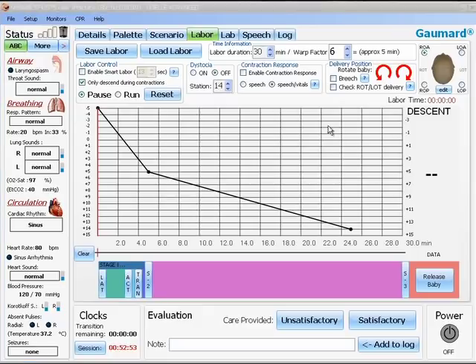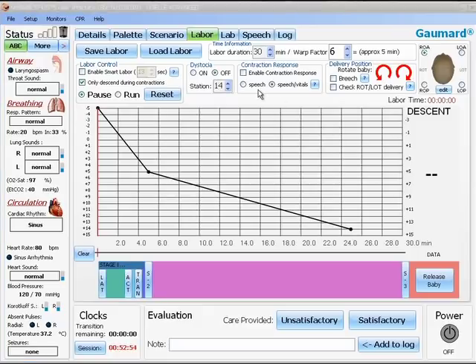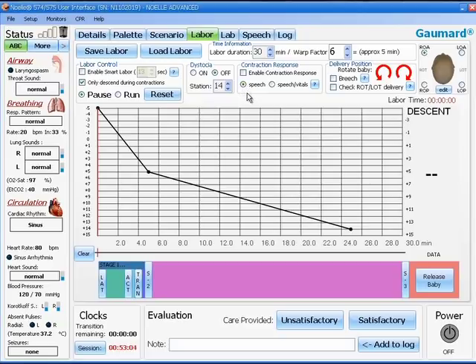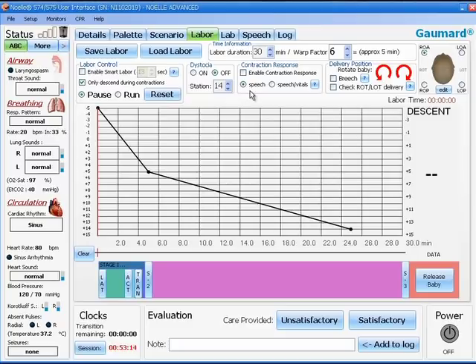The next box is entitled contraction response. There are two possible responses to contractions. One is a speech response, whereby Noelle will react to a contraction with speech palettes. If you select both speech and vitals, there will be a speech palette response and an increase in the breathing rate and the heart rate during each contraction. The check box turns this contraction response on or off.